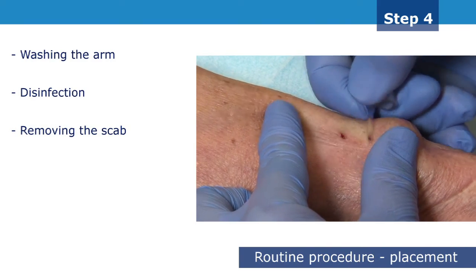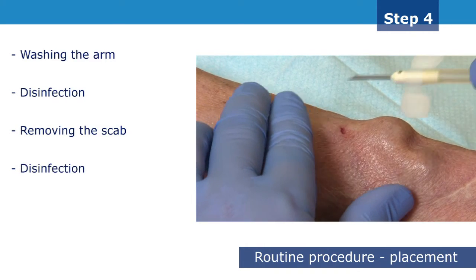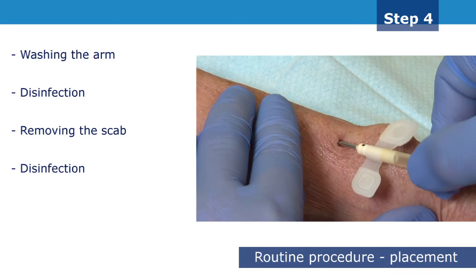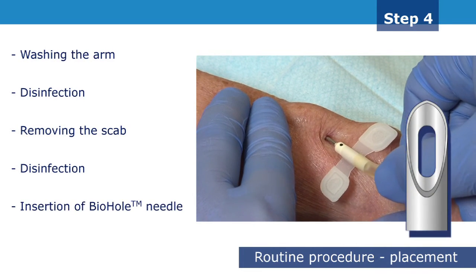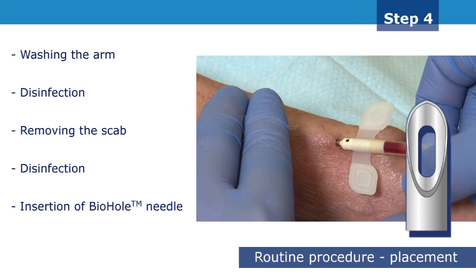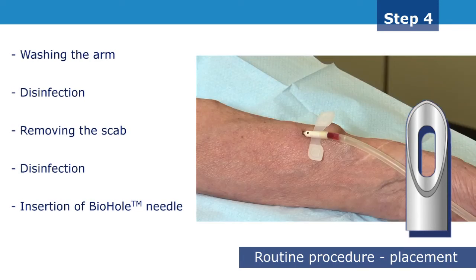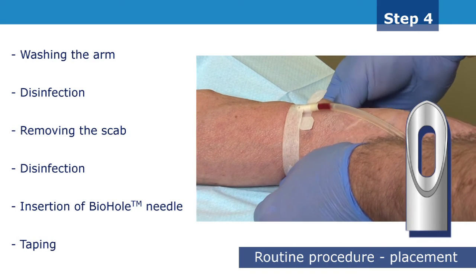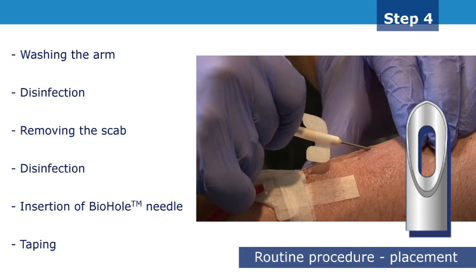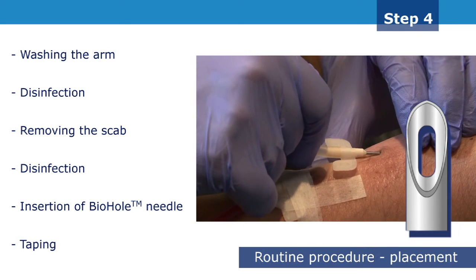The second disinfection of the puncture sites must now be done. Slide the biohole needle gently into the established tunnel track, preferably holding the needle by the tube. Widening of the puncture site can be prevented by leaving a small space between the hub of the needle and the puncture site. Tape the needle and check for any flashback of blood. If moderate resistance is met, pull back the needle a few millimetres, then rotate it gently while pushing it forward using some light pressure.